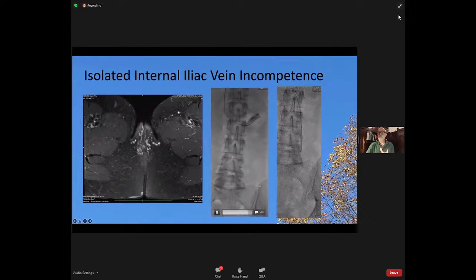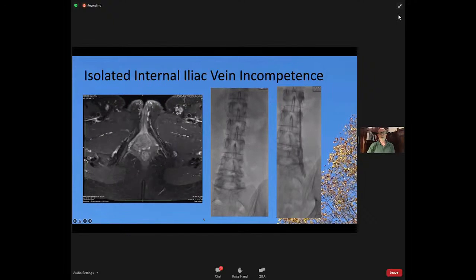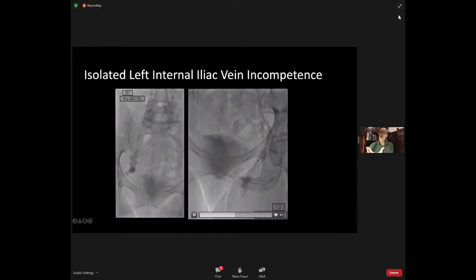And we can see this grossly, actually this one, sorry, wasn't associated with ovarian vein incompetence. We can see the left ovarian vein is actually kind of patent, but certainly when we went into the pelvis, we saw gross pelvic incompetence. So here's this patient with a catheter in the internal iliac vein, Valsalva, and you can see she's dumping all these veins directly into the perineum.